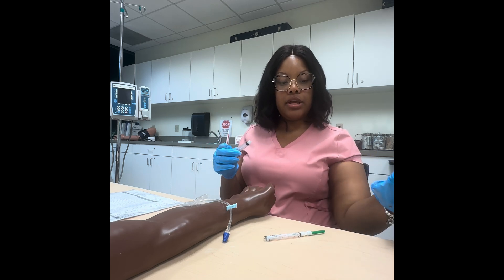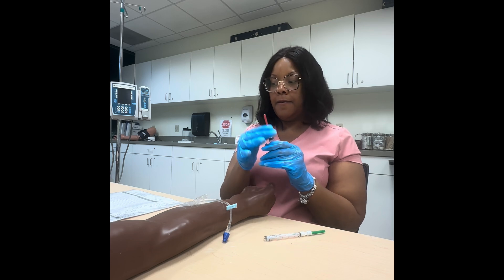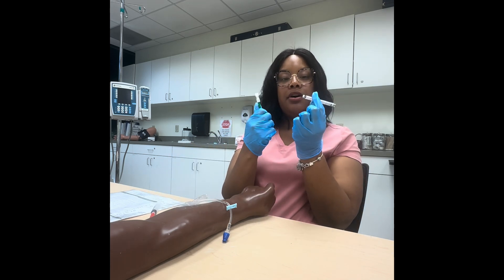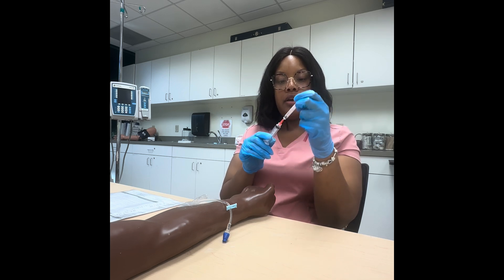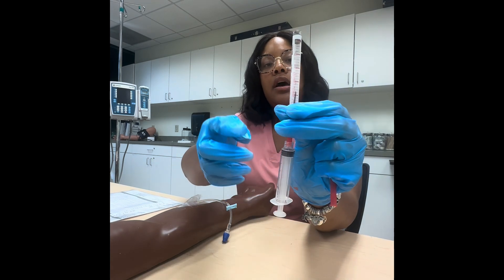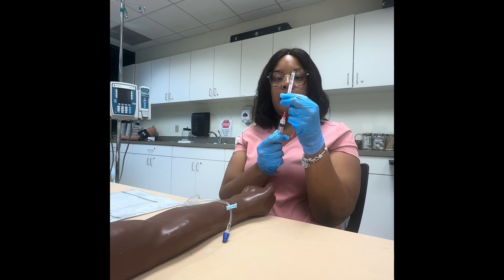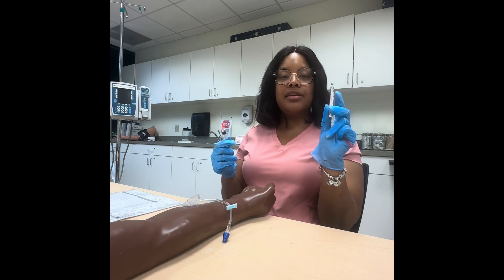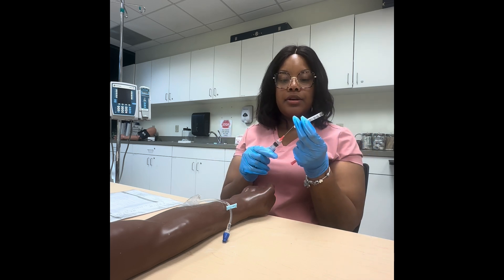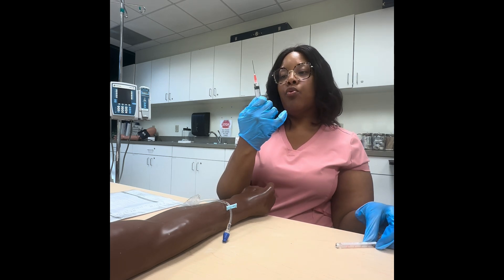We need a blunt tip needle to pull the medication out of the vial. Twist it onto the syringe and it pops off. You don't need to alcohol wipe this because it's brand new. Stick the blunt tip needle into the vial and pull out one mL — this syringe has the mLs marked right on the side. Make sure you get your one mL drawn up.